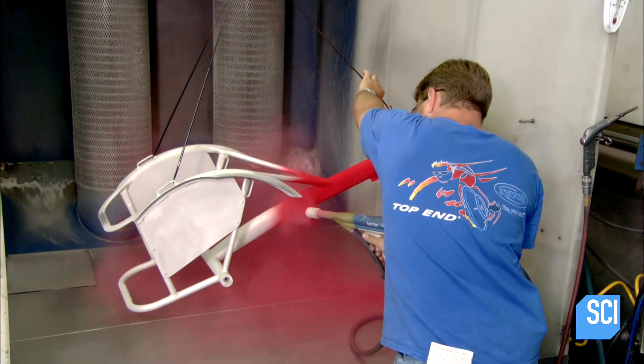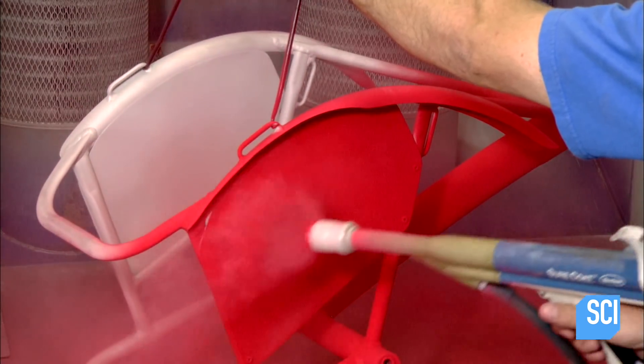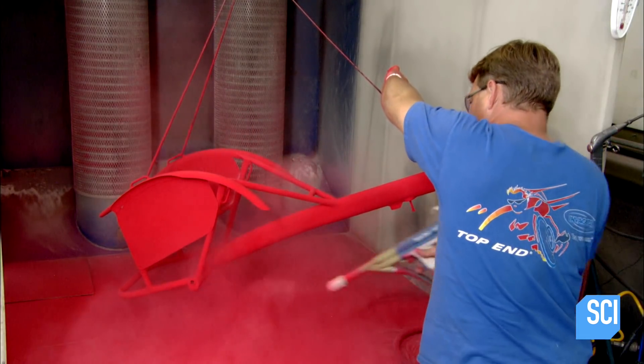To make it look flashy, they spray paint it red. This is a powder coating — a thermoplastic paint that's tougher than the conventional kind.